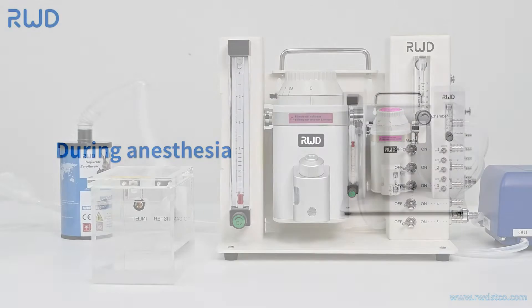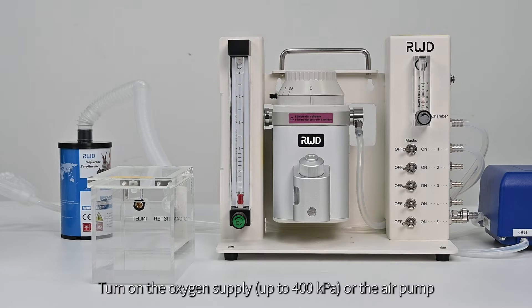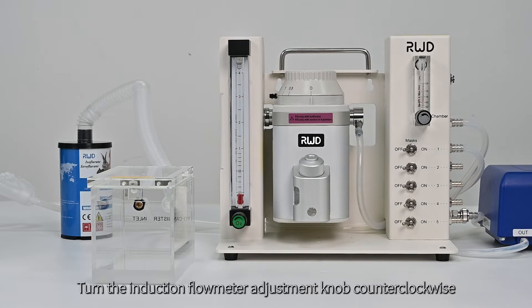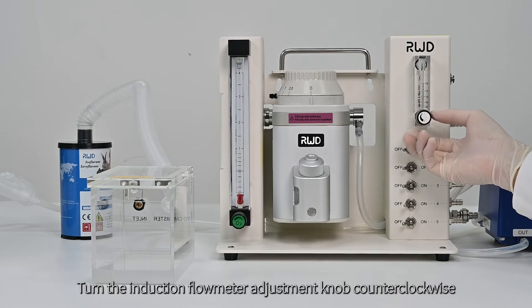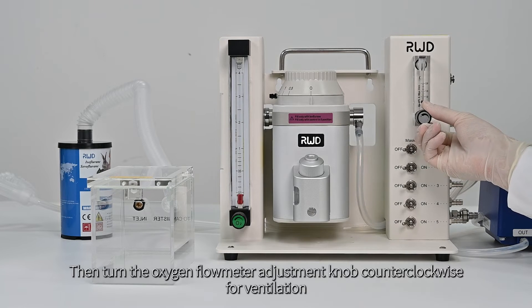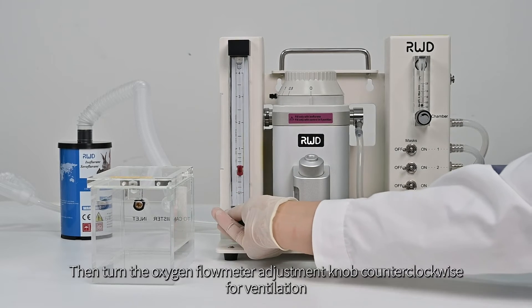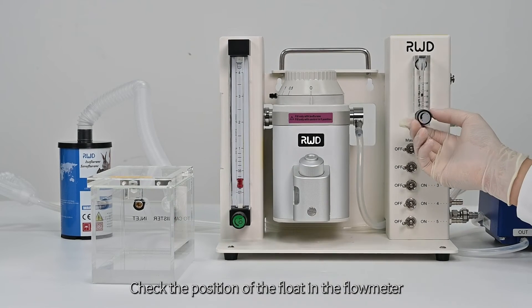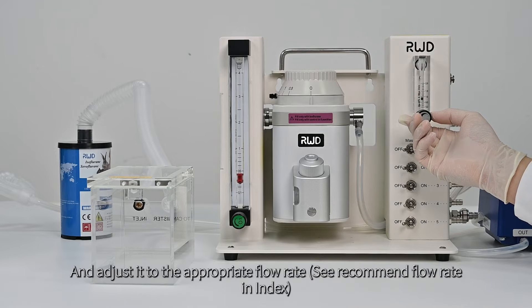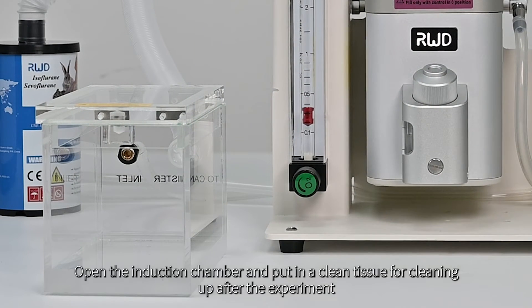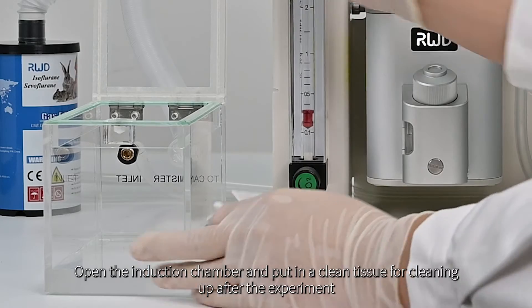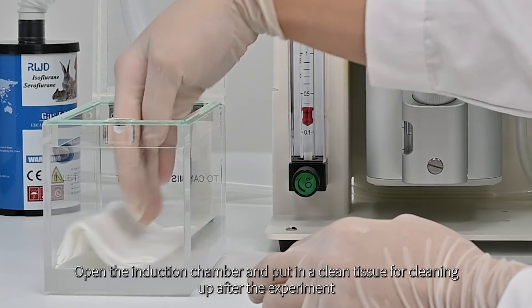During anesthesia, turn on the oxygen supply or the air pump. Turn the induction flow meter adjustment knob counterclockwise, then turn the oxygen flow meter adjustment knob counterclockwise for ventilation. Check the position of the float in the flow meter and adjust it to the appropriate flow rate. Open the induction chamber and put in a clean tissue for cleaning up after the experiment.